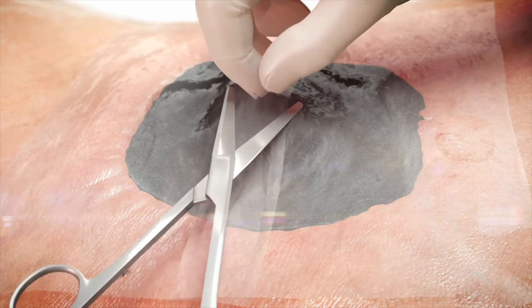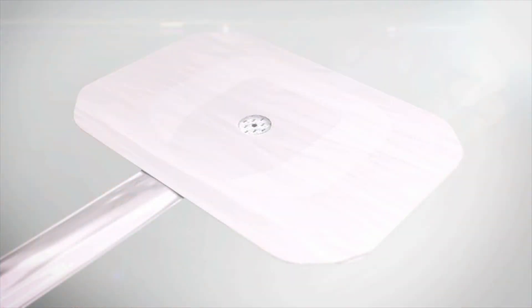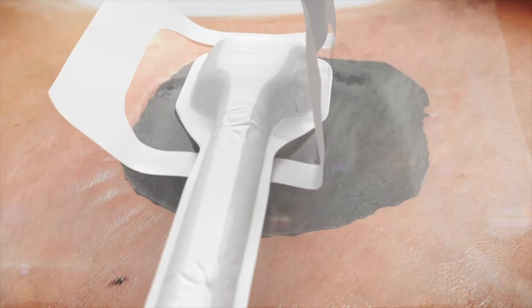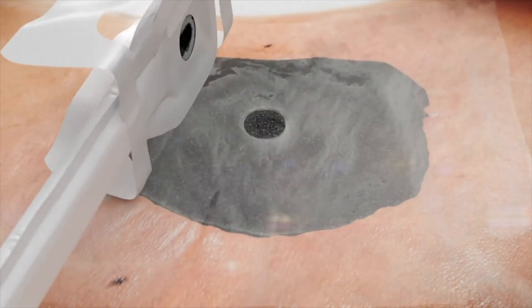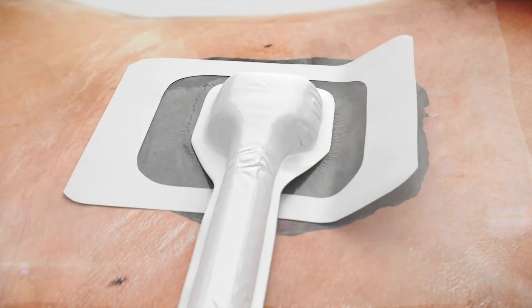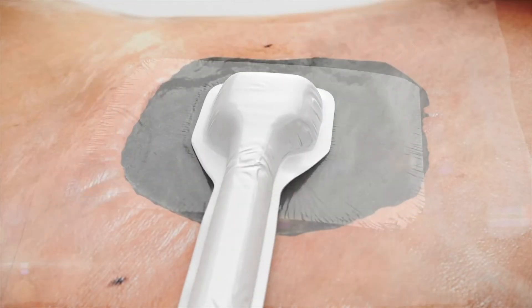Cut a circular opening no less than 2 cm in diameter in the centre of the film over the foam. Remove any loose transparent film and dispose of away from the wound. Remove the adhesive panel from the Renesys soft port dressing and align the port opening over the cut hole in the transparent film. Use gentle pressure to anchor the soft port to the transparent film, smoothing the dressing down while removing the soft port's top stabilisation frame.